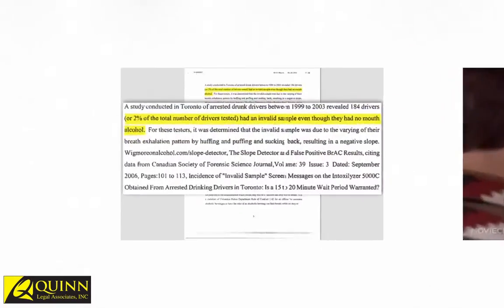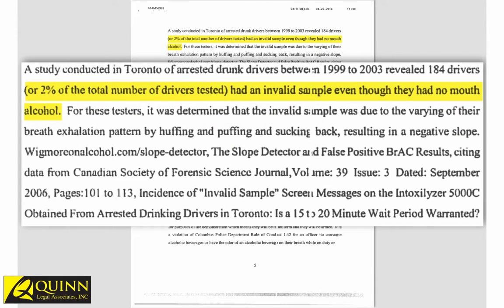And then this is one of Cleve's cases in which the prosecutor tried to keep Cleve from using any type of demonstration video. They basically say that 2% had an invalid sample even though they had no mouth alcohol.